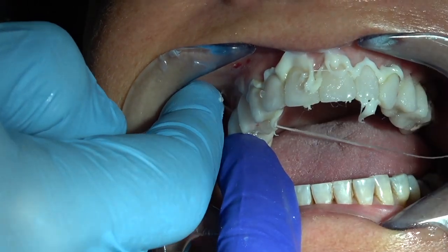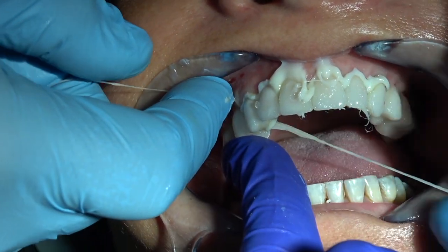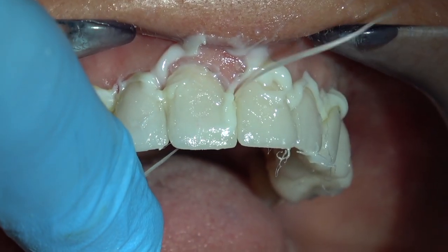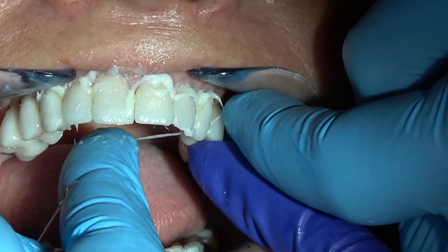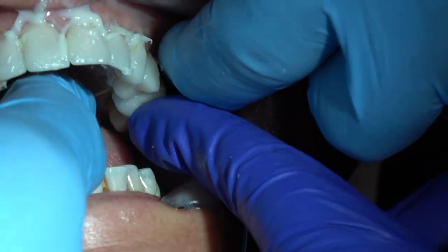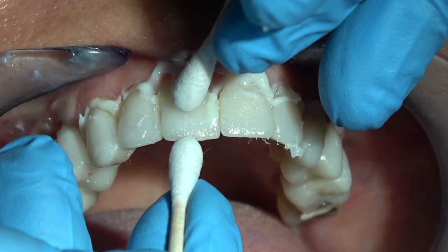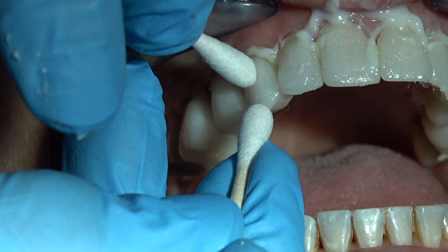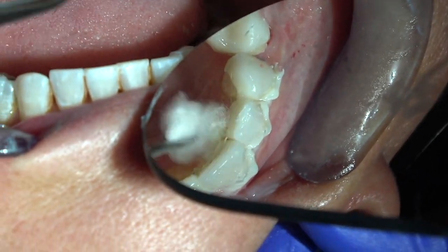Then I'm going to have my assistant put her finger on the crowns and I'm going to pop floss between them before the cement sets. Then I pop that between each of these veneers - not removing the excess luting composite, just getting the cement out of the interproximal contact. Then I go back and push them to place again. I've got all the time in the world because these don't cure until I hit them with the curing light. When you pop floss between them they may move just a tiny bit, so push everything back to place.